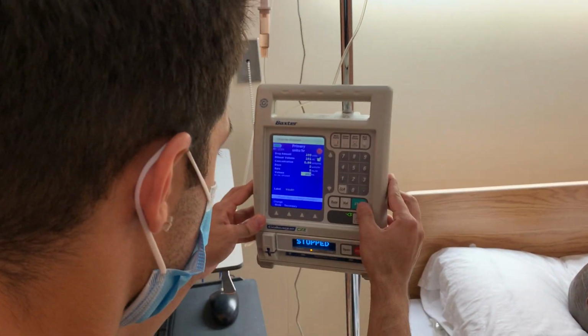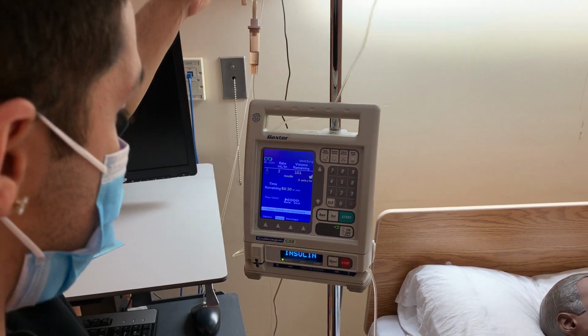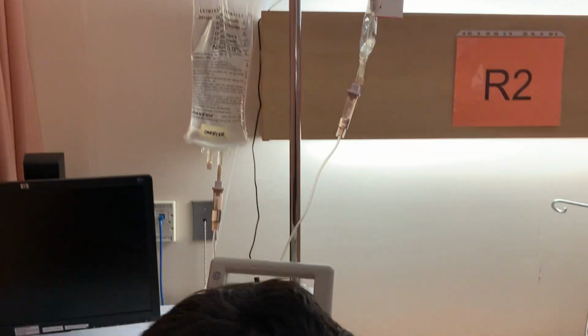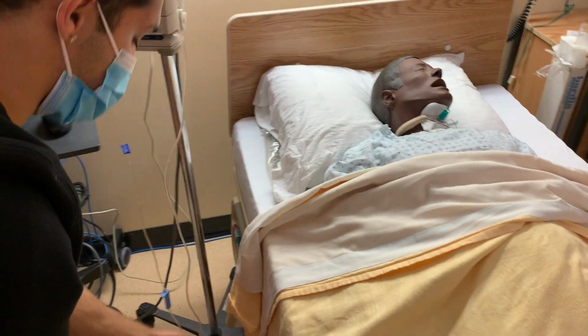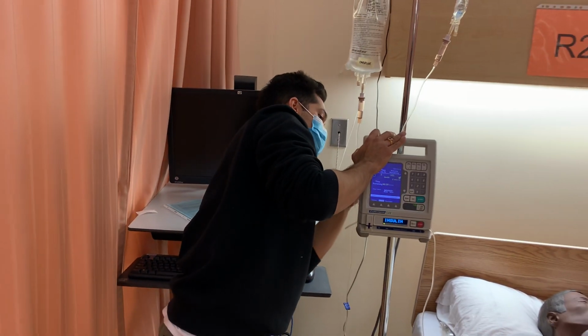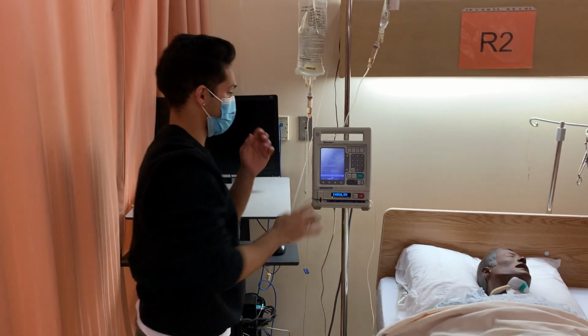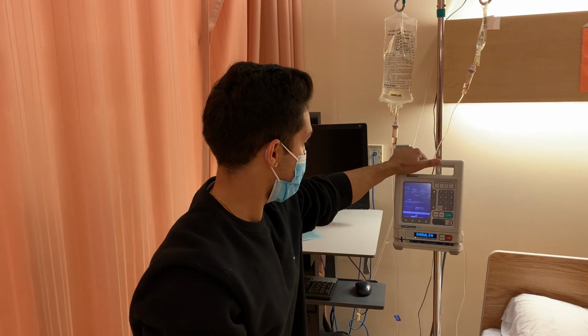I'm just going to be starting this. And I've already made sure that the primary TKVO of normal saline is running, and that's compatible. I'm making sure my clamps are open, everything seems to be infusing. Now I'm also going to be locking the pump from the back. I've locked the pump, so now nobody can mess around with the pump, it's locked and nobody can change it.